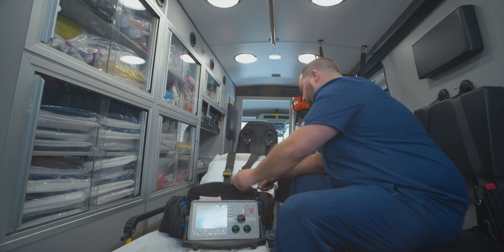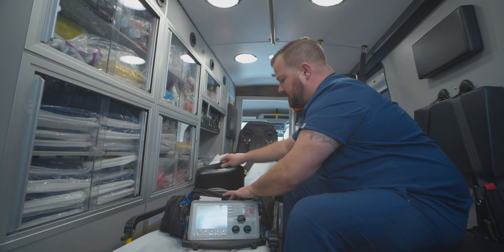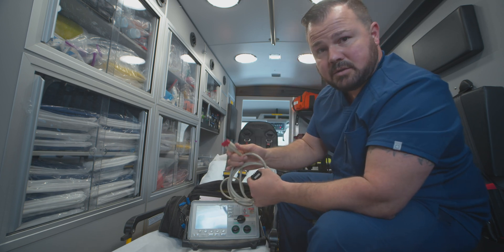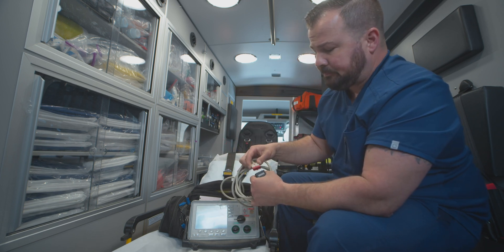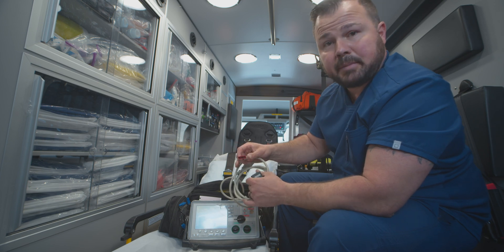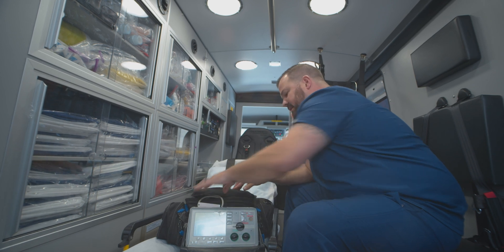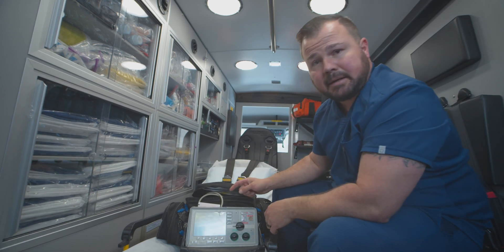You're going to make sure that you have the test load plugged in. That's what would connect to your pads, your pacer pads. Just make sure it's plugged in. If it doesn't allow you to do the defib, it's because that's not plugged in.